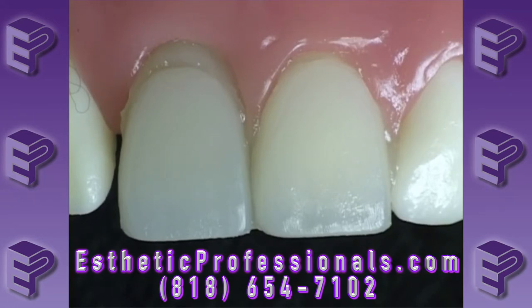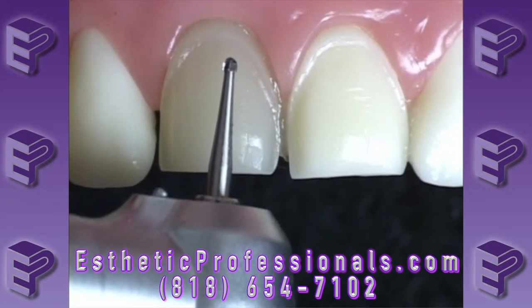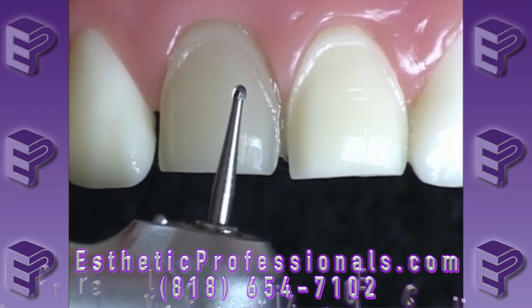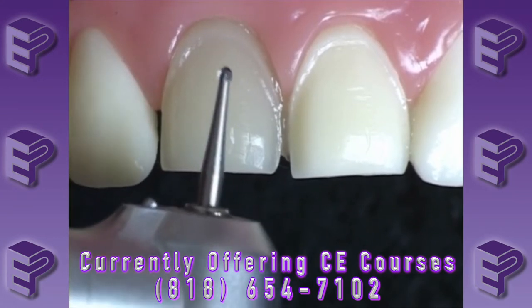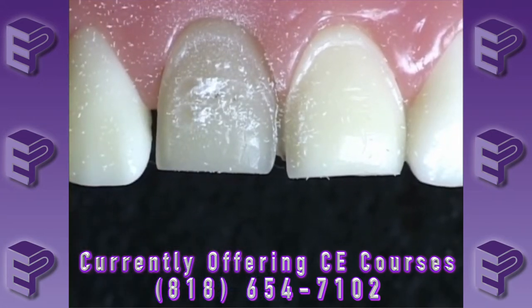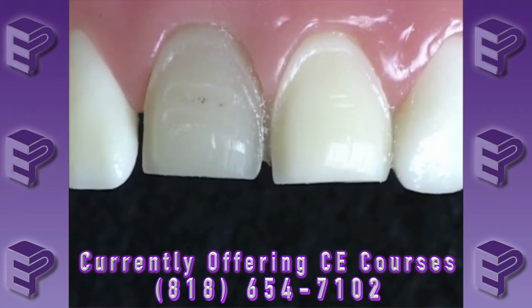So we always need to make this determination clinically at our try-in appointment to find out the magnitude of the problem. Now we know and verify that there is a problem. We're going to go ahead and remove these veneers, clean them up, and start our sub-opaking technique. We need to create a little space for our resin tints and opakers, so we're taking this number 2 round burr. If you measure this, it will give us about 0.075 or 75 microns worth of blockout. We're going to make a couple of depth cuts in our veneer, which is going to be about 75 microns deep.